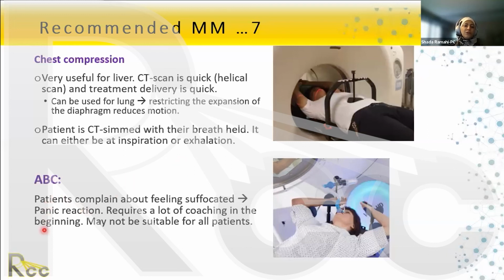Active breathing control is sold by a vendor. It's a form of shallow breathing. So you're forcing the patient to breathe shallow and also with a slow rhythm.